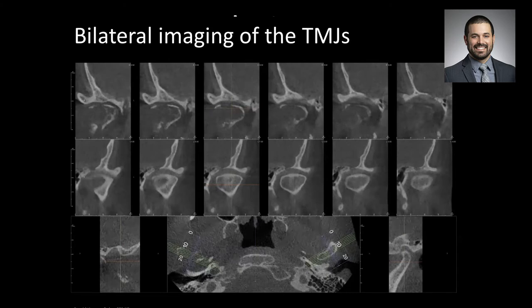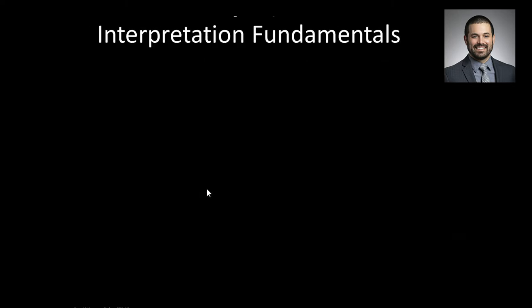And again, I'm glossing over a lot of details here. But the disease wasn't responding to normal first-line therapy, so they elected for imaging, and we found this very destroyed appearance to the condyle on this side. This turned out to be a metastatic breast carcinoma that had planted itself in the condylar head. Now, that's a very rare and frightening case, and they do not happen all the time, but it can happen, and this is one example.